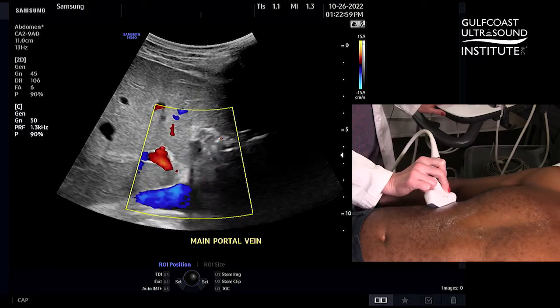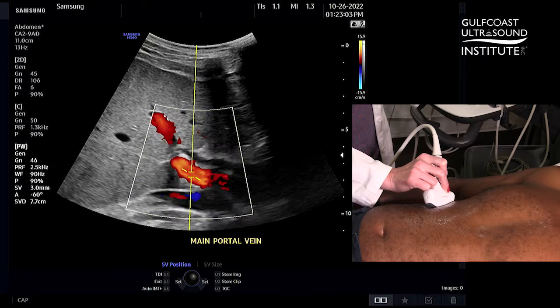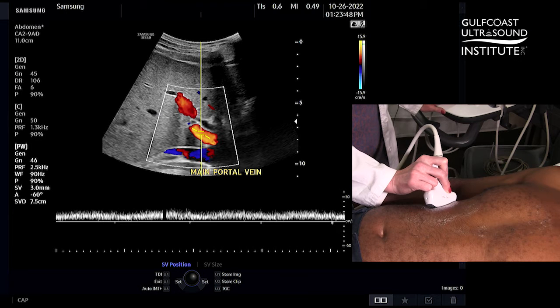Next, have your patient take a small breath in and hold it, and activate your pulse wave Doppler. Now that your main portal vein is at a good angle, your Doppler should be nice and clear.